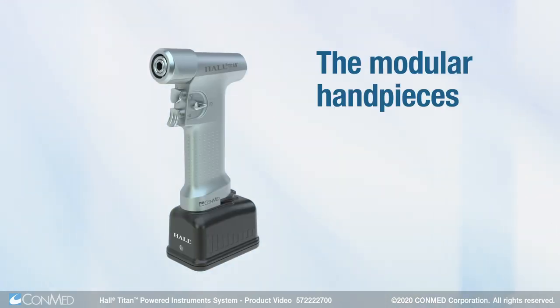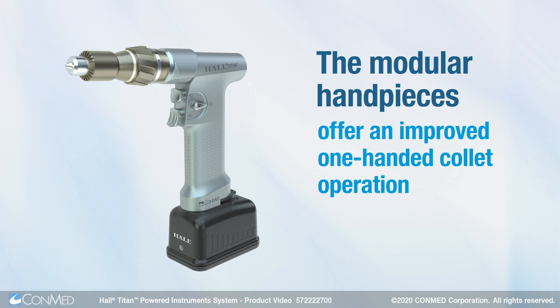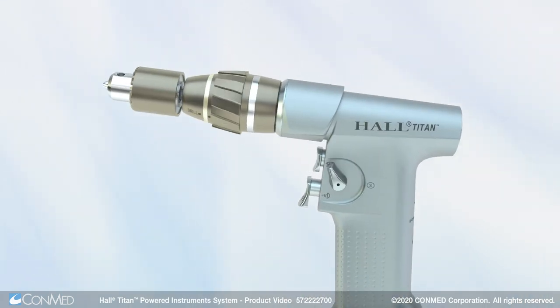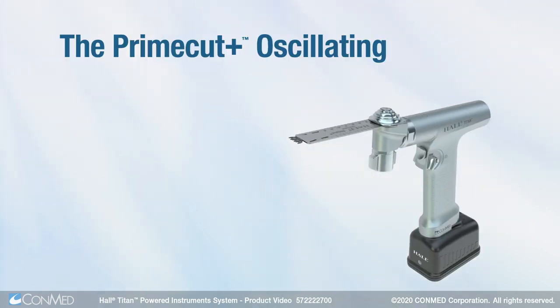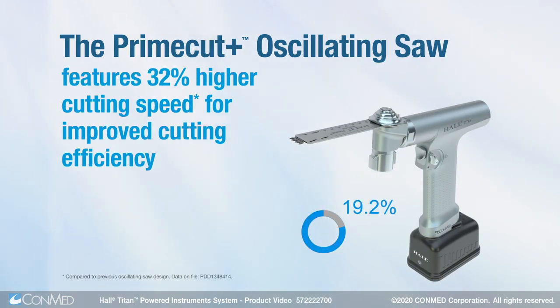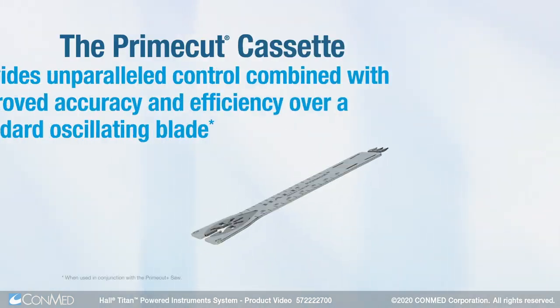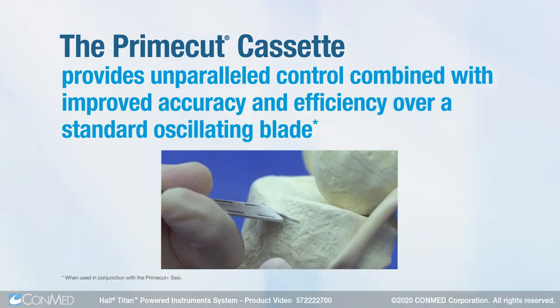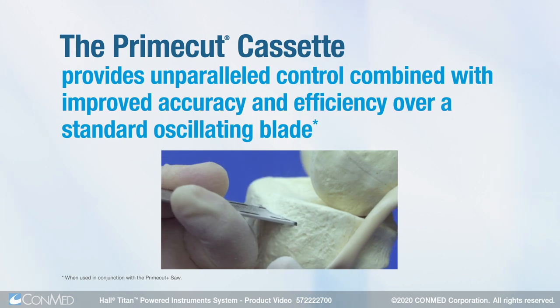The modular hand pieces offer an improved one-handed collet operation and redesigned triggers for intuitive ease of use. The PrimeCut Plus oscillating saw features 32% higher cutting speed for improved cutting efficiency. The PrimeCut cassette provides unparalleled control combined with improved accuracy and efficiency over a standard oscillating blade.